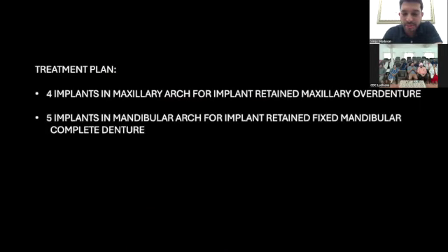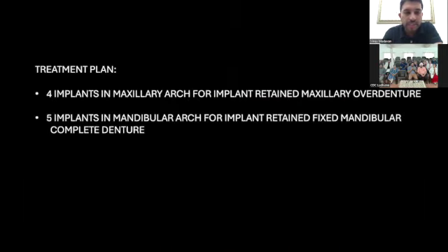So in this patient, as you can see, we established the occlusal plane. We made sure that we had a good incisal edge position, display, and all that kind of stuff. And at this stage, because I wanted to provide flange for my patient, we gave her options. She did want to have implants in the maxillary arch as well.